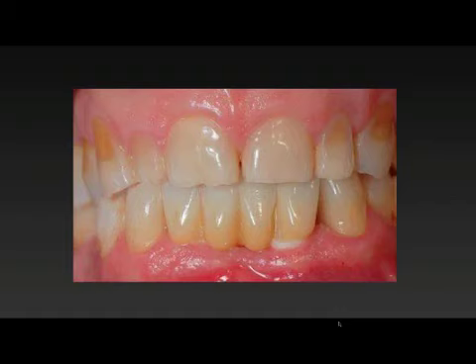maintenance than the 3-tooth approach. But this was what the patient wanted, and this was a little bit of a compromised result. So again, as with any implant out there, we want to choose our cases wisely. We push the limits sometimes with certain materials. There is no single implant that can solve all of our problems. We have to be cognizant of that.